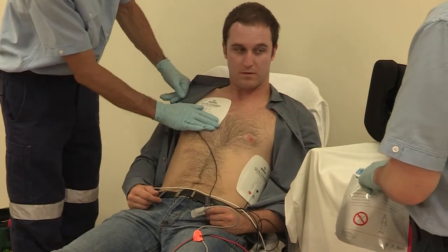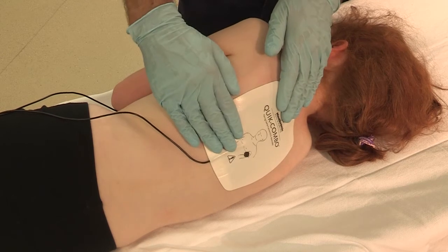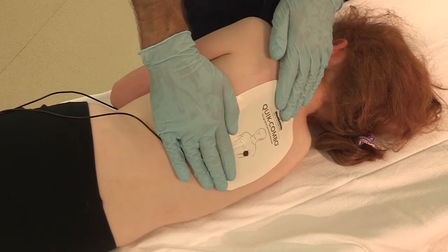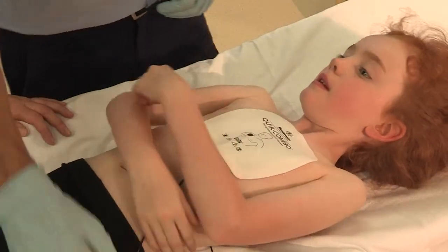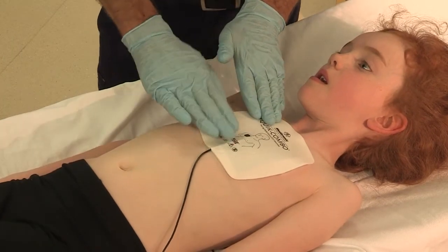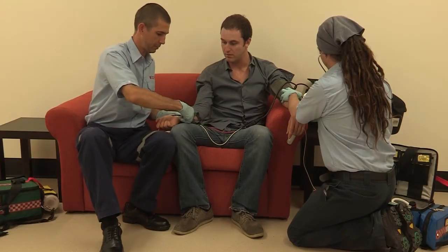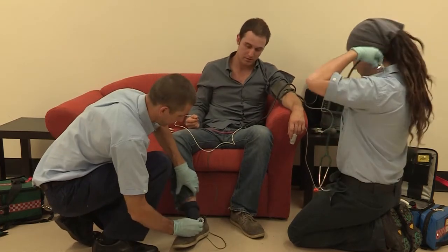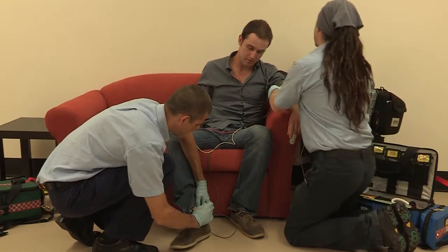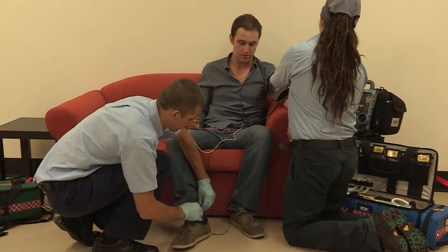An alternative placement can be to place the negative pad onto the left anterior chest wall and the positive pad onto the back, below the left scapula and to the left of the spine. This may be difficult if your patient is obese and difficult to move. The limb leads can be placed anywhere on the limbs, but try to avoid bony prominences or large muscles, as these can cause interference. Limb leads should not be placed on the torso, as they are designed to be used on the limb.